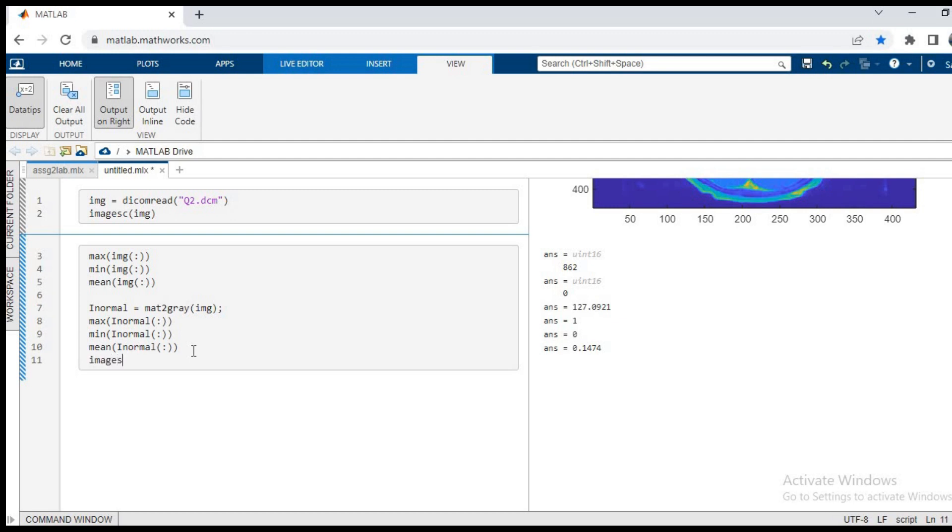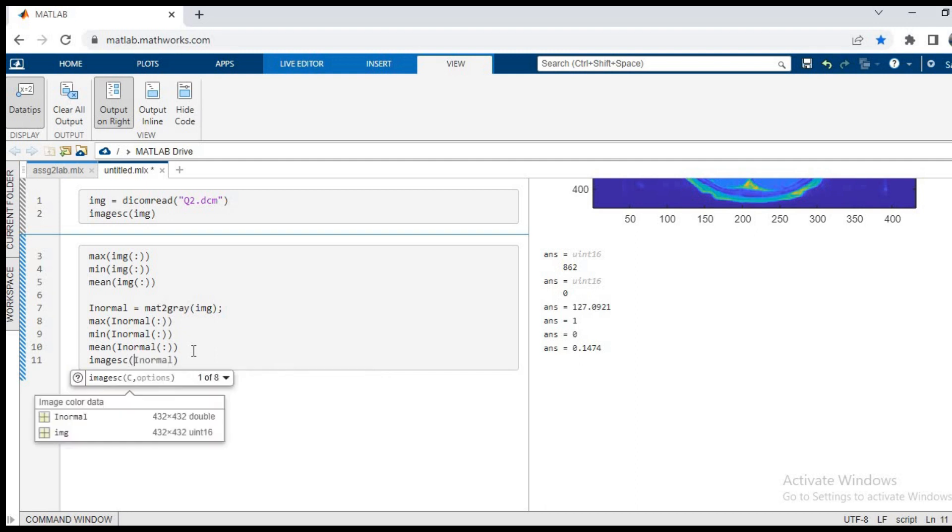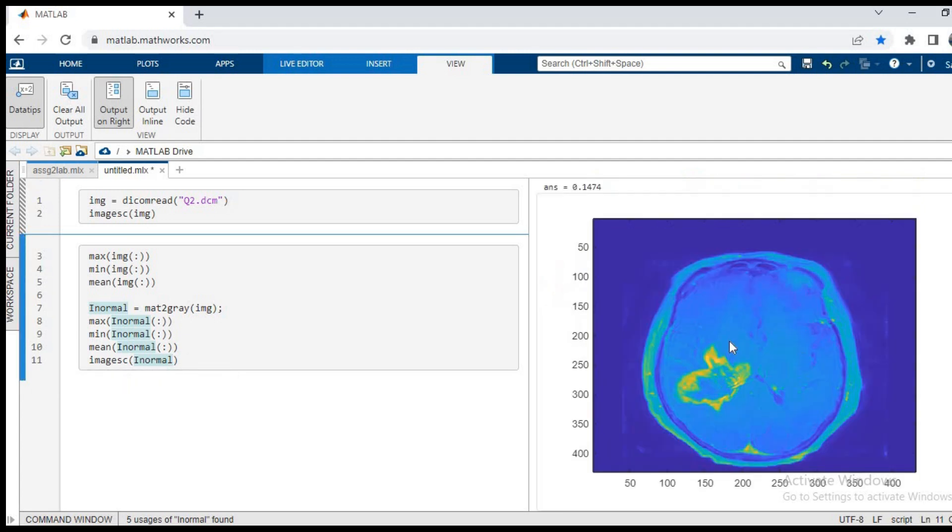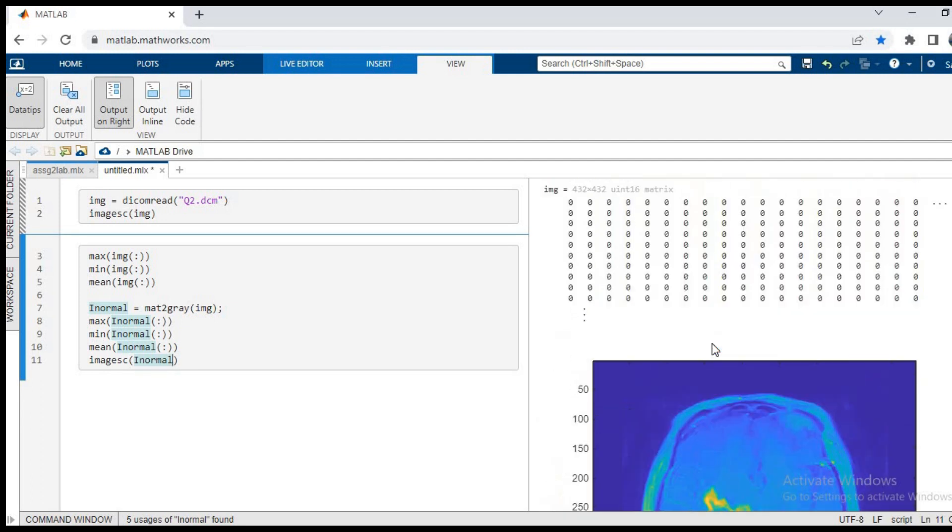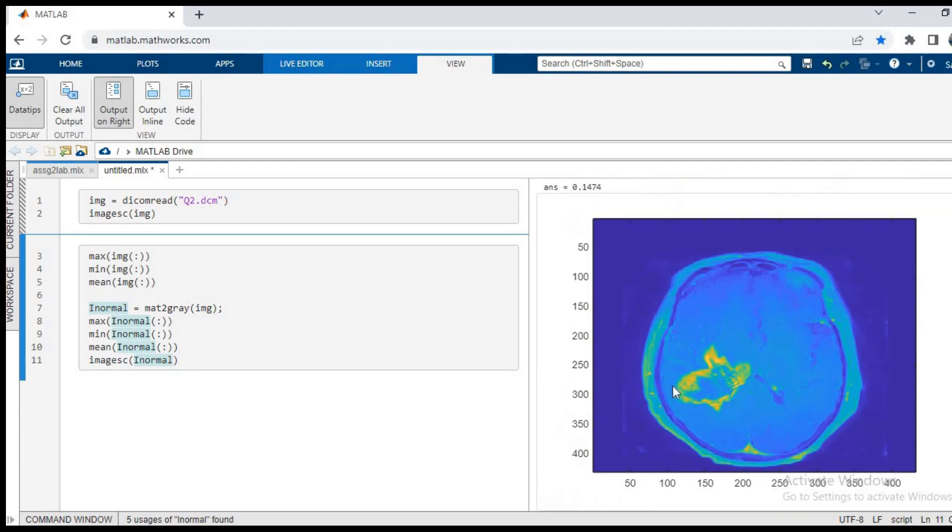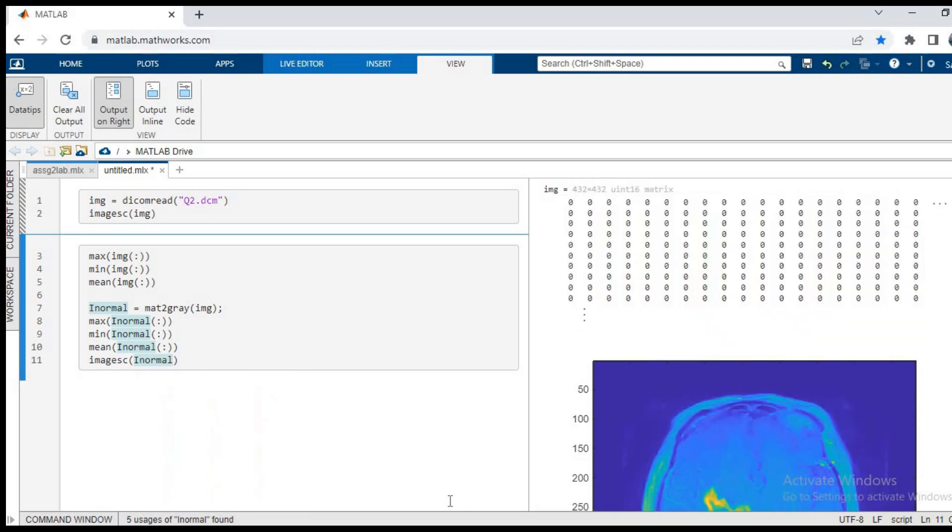Now let us see if there is any difference in the image. We'll type again image sc and now we will pass the i normal image, the i normal matrix. We'll press ctrl plus enter and wait for the output. As you can see, the output has no difference. The image in my previous case, from 0 to 862 intensity value, and now the normalized intensity values, they appear both the same.